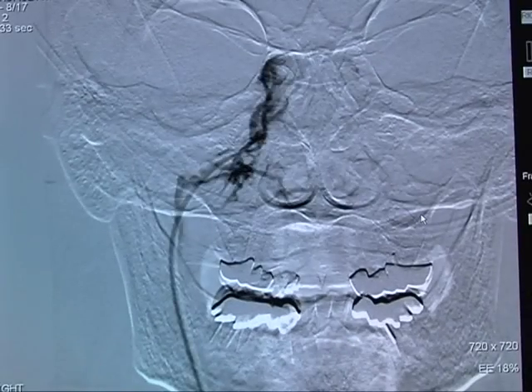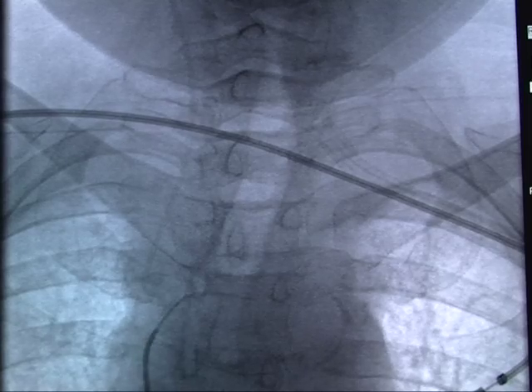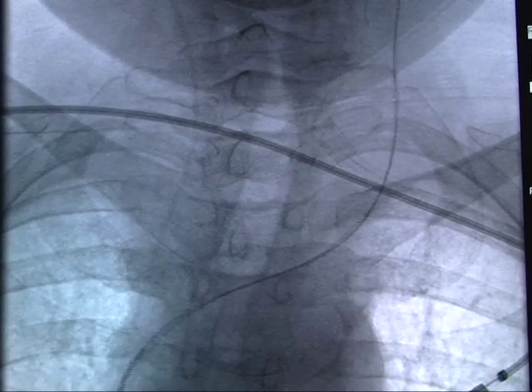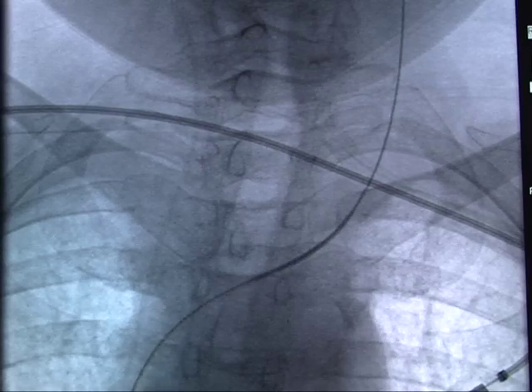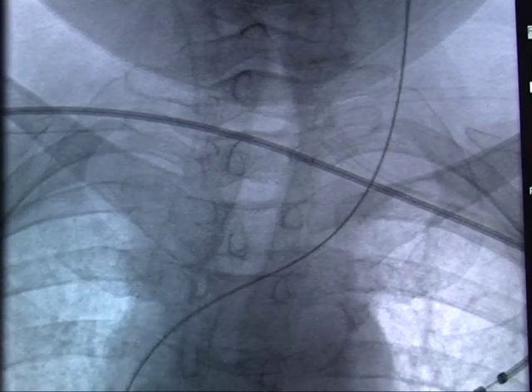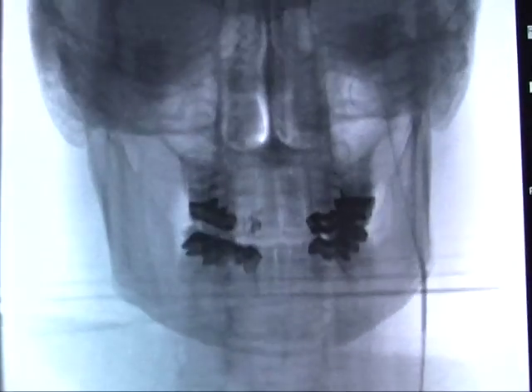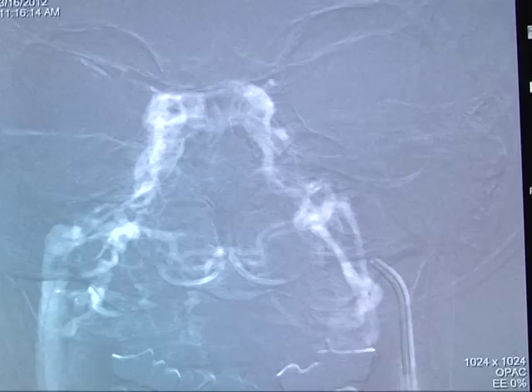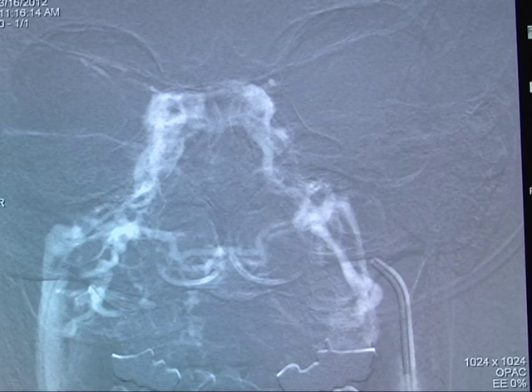There is good communication between the right and left cavernous sinus. A second catheter is now advanced across midline into the left internal jugular vein. The catheter is being advanced.